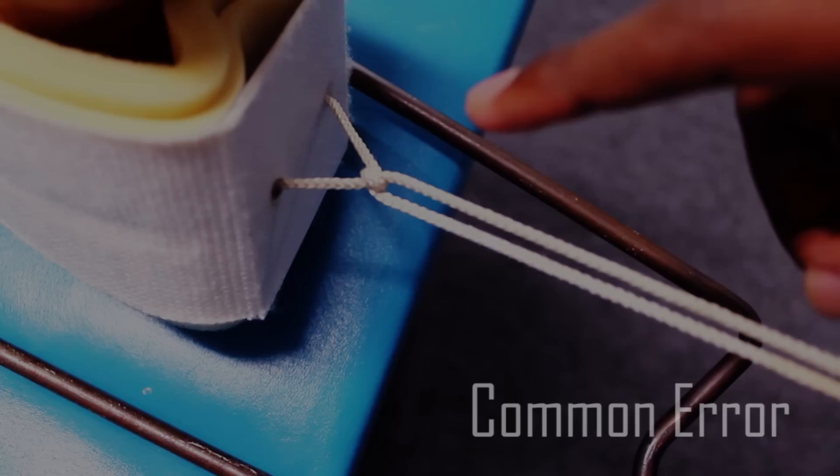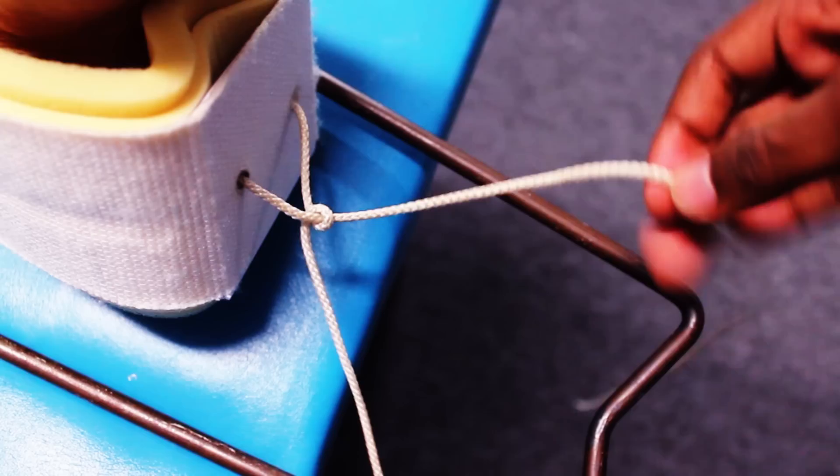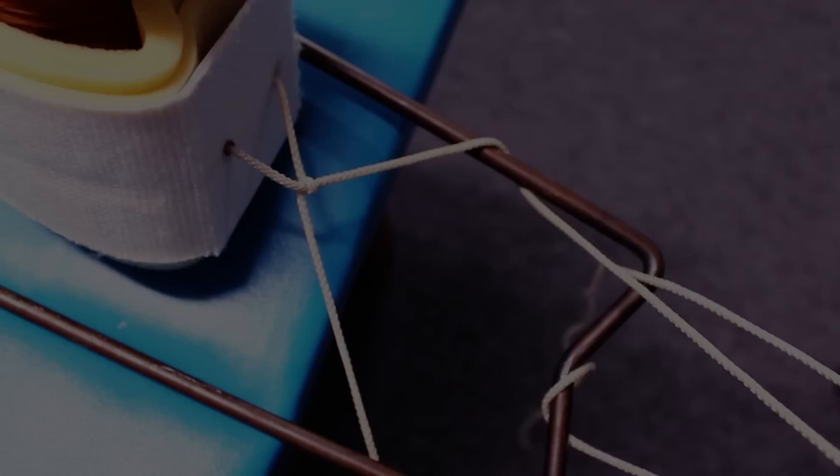A common mistake is to tie a knot first before threading your strings over and under. This is not secure, as you can see.